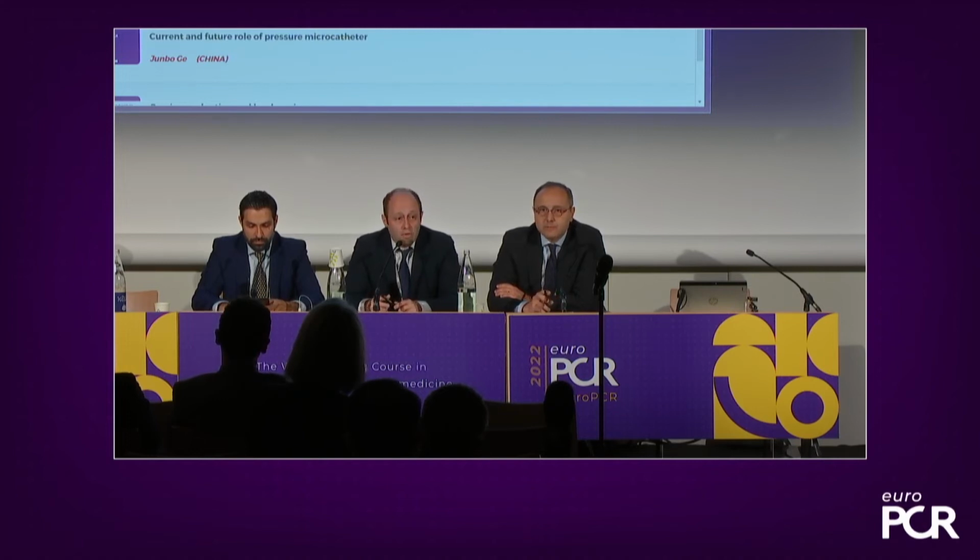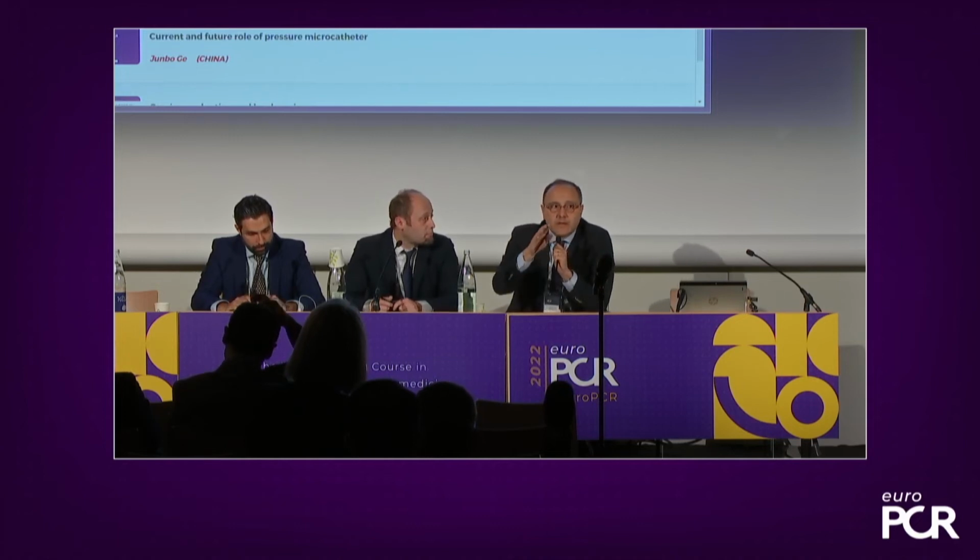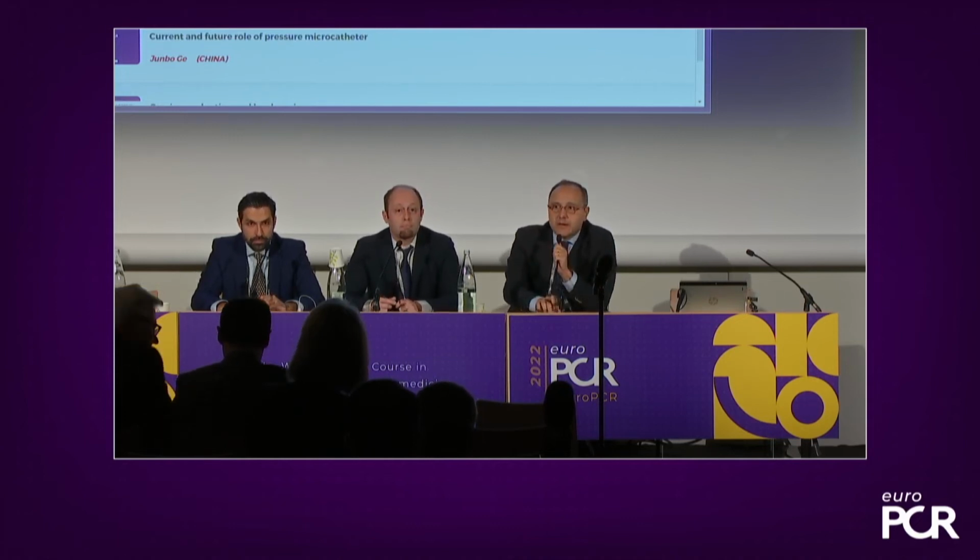So to use physiology in this case could be helpful to achieve a better vascularization of the RCA, and we will continue in the case also to understand if we need to treat all three vessels. This is really important. When you have a complex disease, physiology can be very helpful to simplify the procedure, achieving a very good result. If there are any comments or questions, please take the microphone.